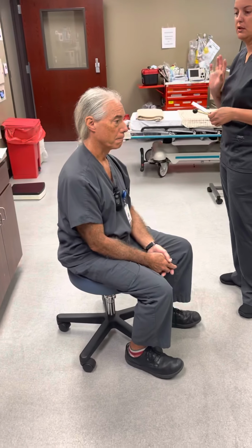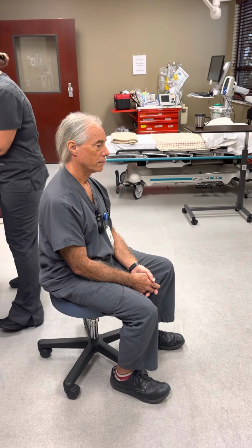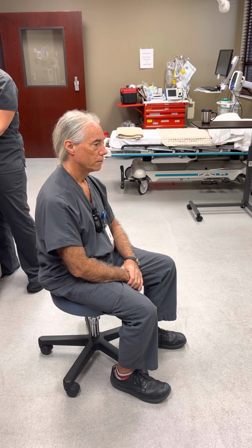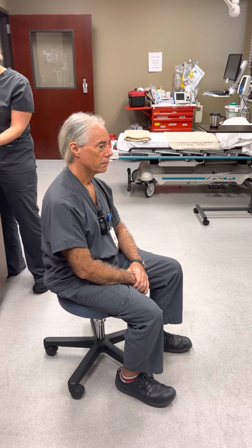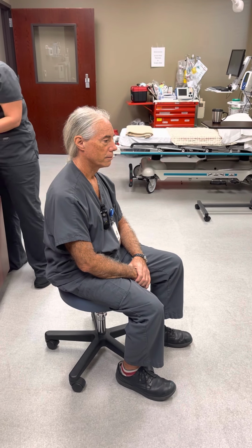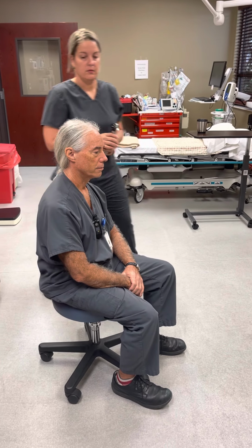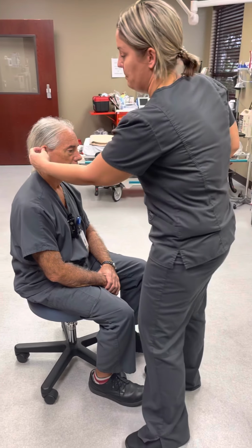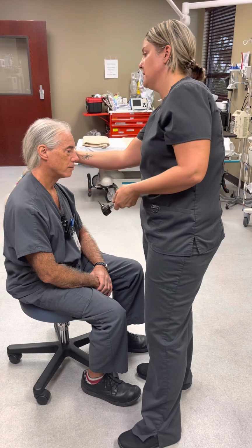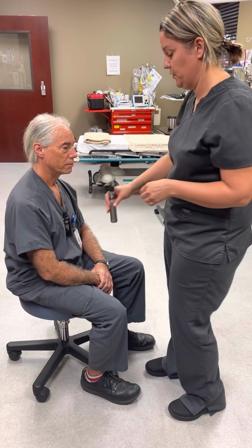So then we're just gonna look at the ears, and we'll use the otoscope to inspect the tympanic membrane. So it has a light on it too. Okay. All right, so we'll just palpate the ears. Any tenderness? No. Okay, and then this side? Any tenderness? No. Okay.